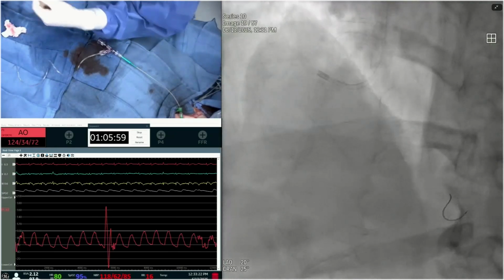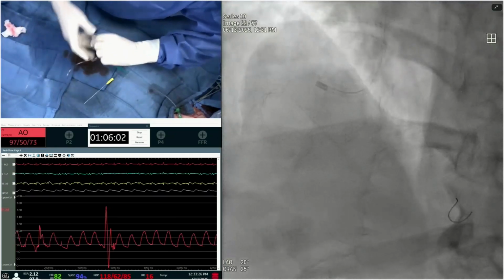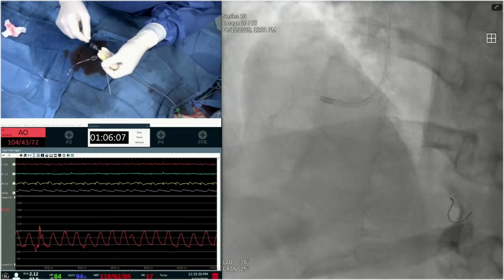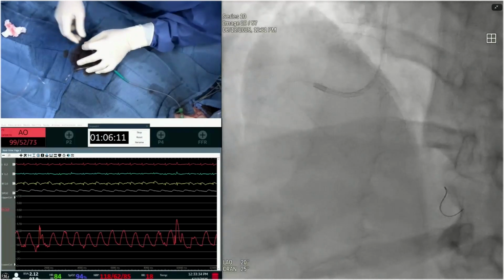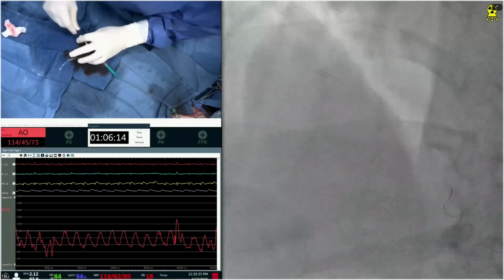That's the wire. Maybe, yeah, that's because we never really touched it. So an important teaching point. We never went that far. It's all the pseudo lesion of the wire. It wasn't there even before, despite all of us using a wire, all of a sudden you see it. You see it, everybody? Good.